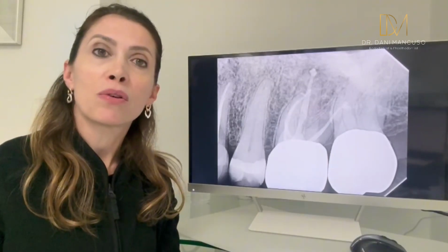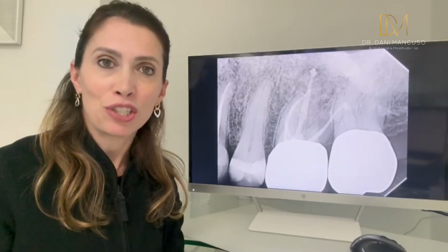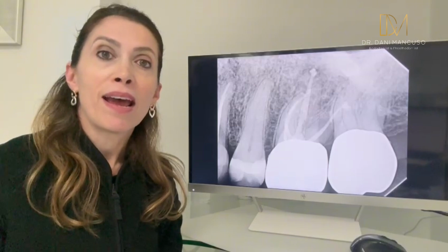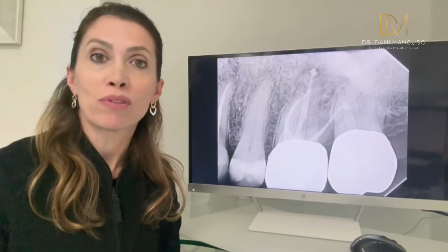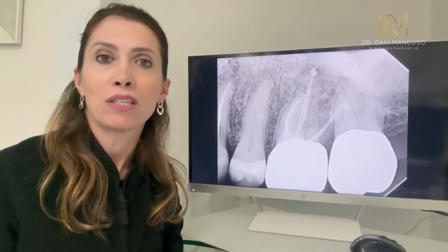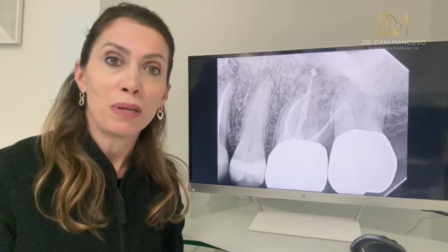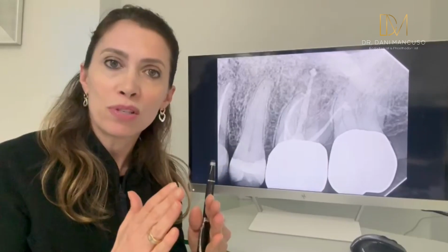The same applies when you try to put the GP in and the GP doesn't go. If it doesn't reach the apex, for example your working length, you have two options. You can try to use a smaller taper. For example, you prepared your canal with a Wave One or a Reciproc, which is 06 taper. Instead of finishing with a 2506 or a 3006 or 4006, you could drop the GP to a 2504. That means that within the canal, that GP won't catch. It will be slightly loose inside the canal.